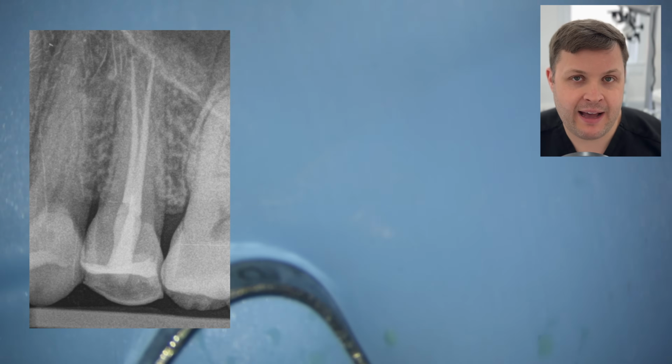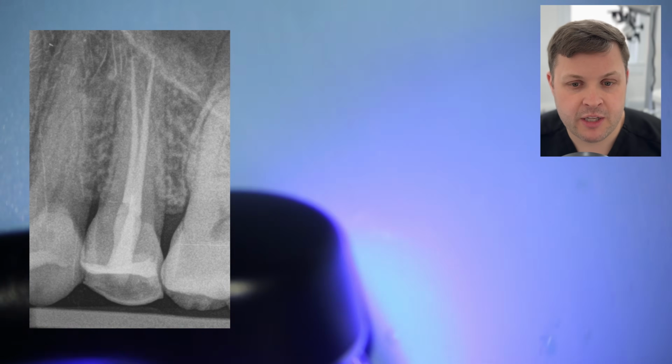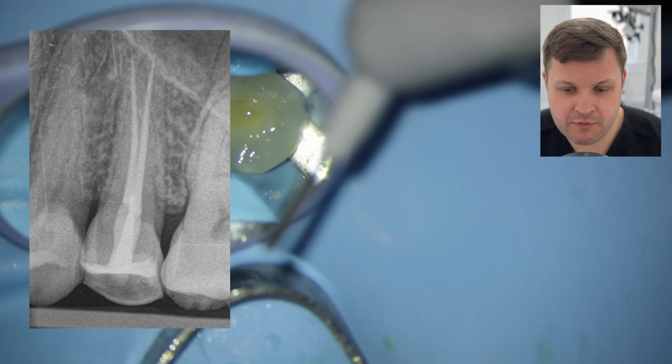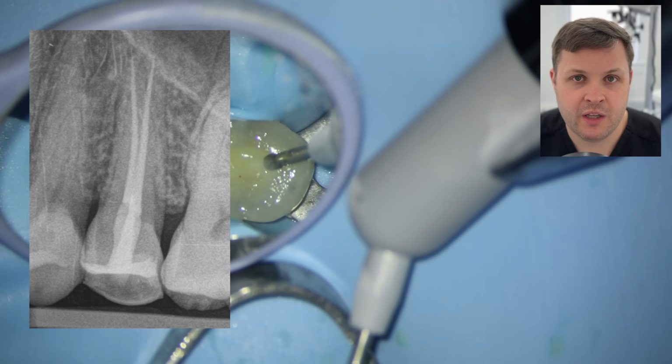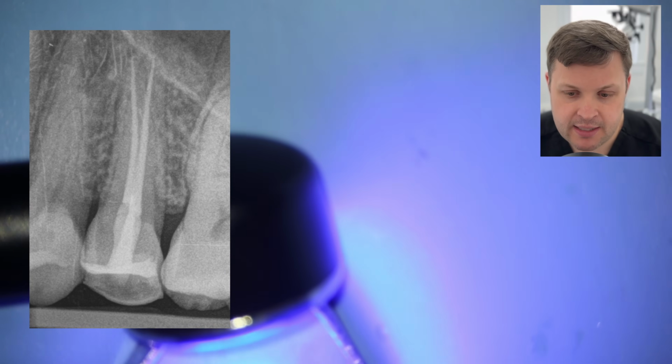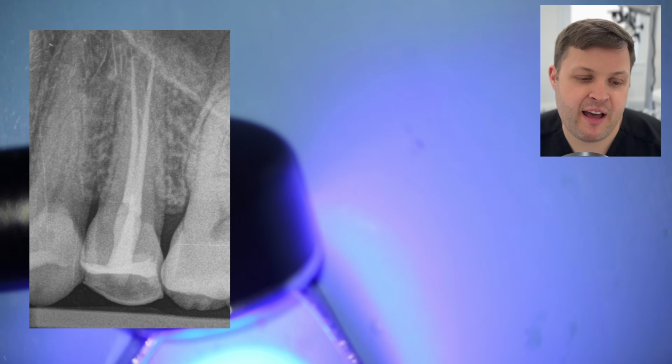I like that we haven't had any kind of sealer puff. Sealer puff isn't the end of the world, but I just like to try and confine it to the end of the root canal. The obturation is to the end, and it looks absolutely fabulous.